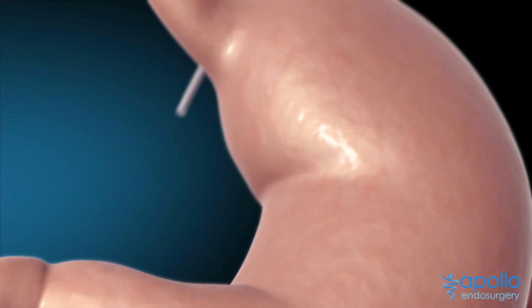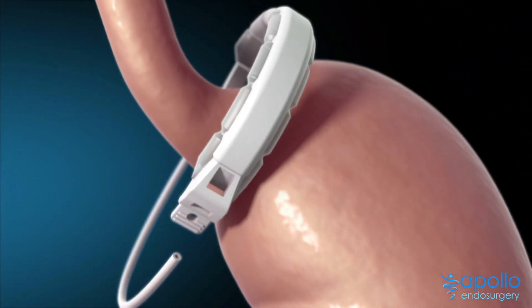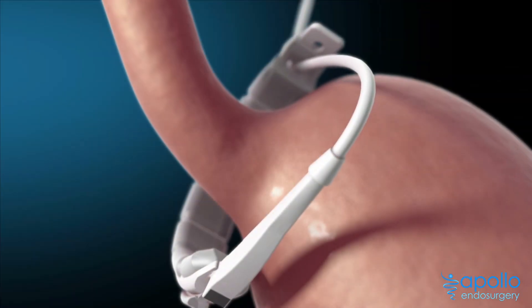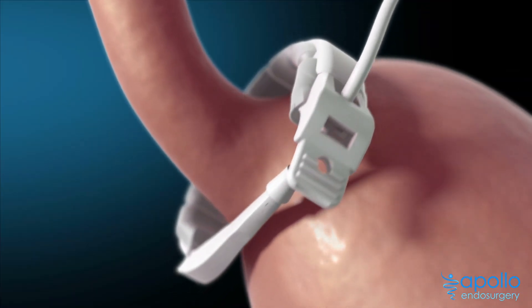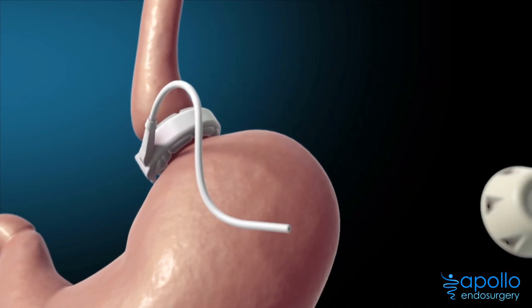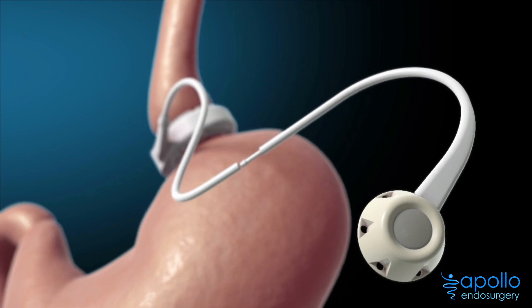During a minimally invasive procedure, an adjustable band is placed around the upper part of the stomach, creating a small pouch. The band is connected by thin tubing to an access port below the skin.